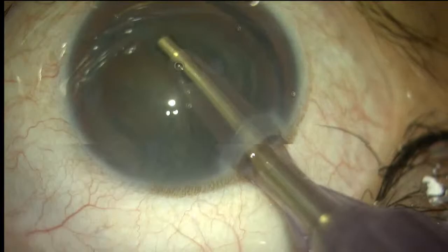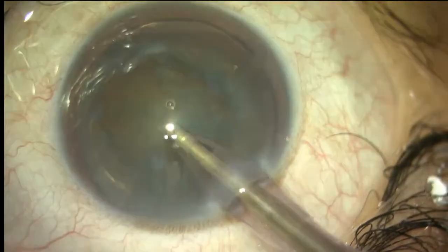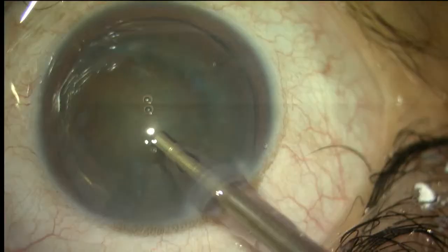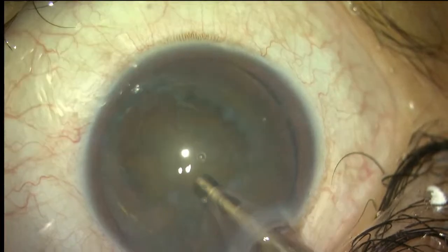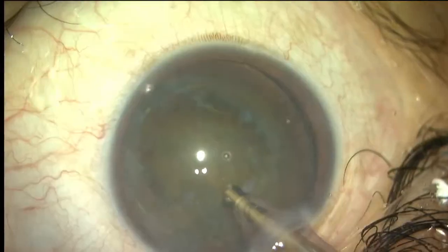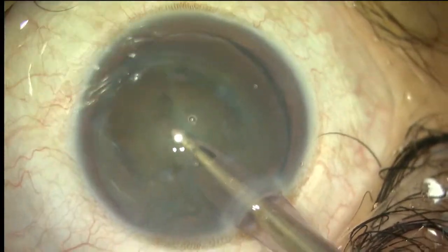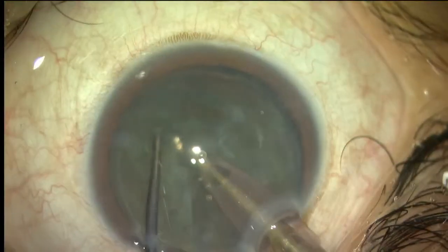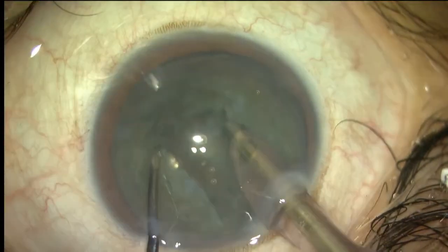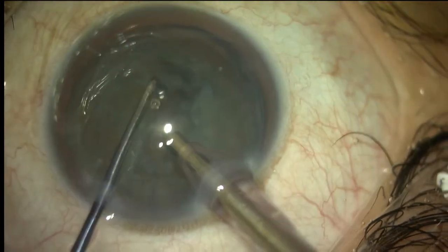I'm just removing the epinucleus. The nucleus is not very hard, so I'll be just showing the stop and chop. It's always better to divide this nucleus. Chop.